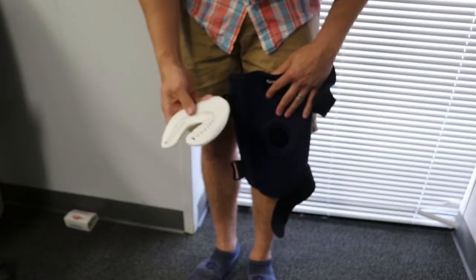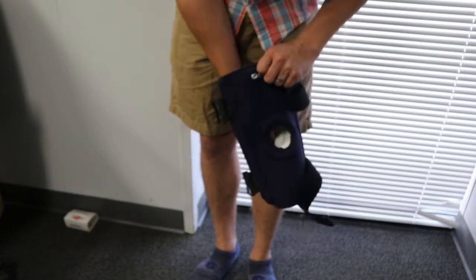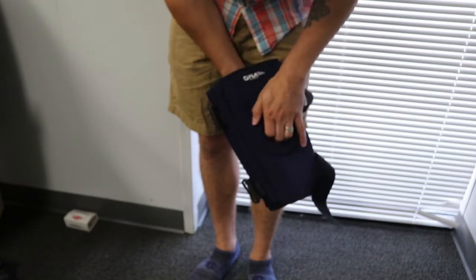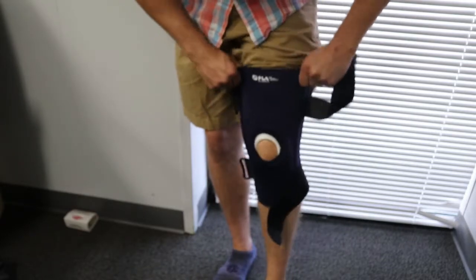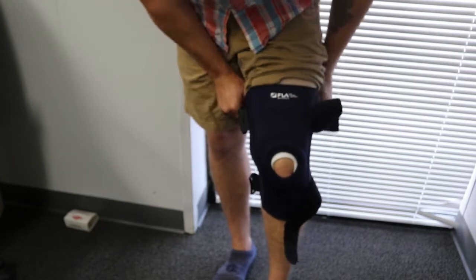Let's go over how to put this brace on. First, the horseshoe needs to be placed where you need the support. Talking to your doctor or therapist about this placement is recommended.